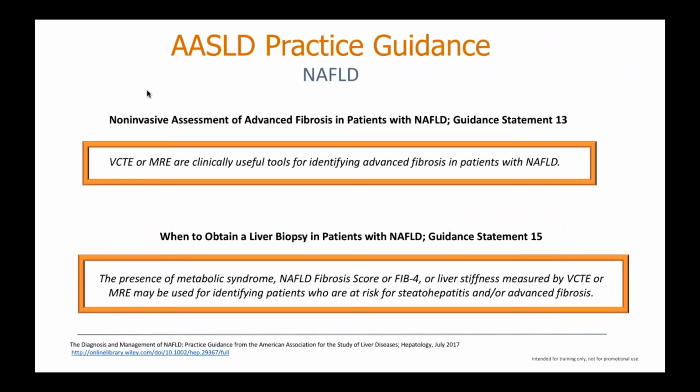Finally, NAFLD. Let's talk a little bit about what we have here. Now here I'm showing you for the first time recent statements from the AASLD practice guidance statement that was just published this summer. They make this statement in that guidance document that VCTE or MRE are clinically useful tools for identifying advanced fibrosis in NAFLD patients.